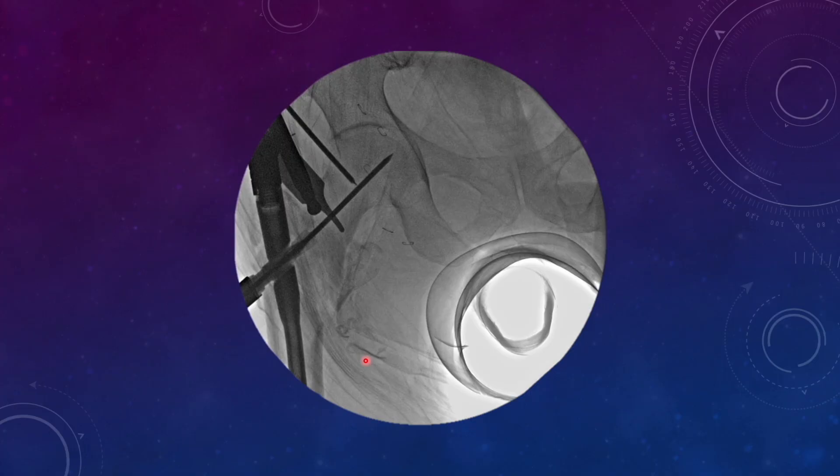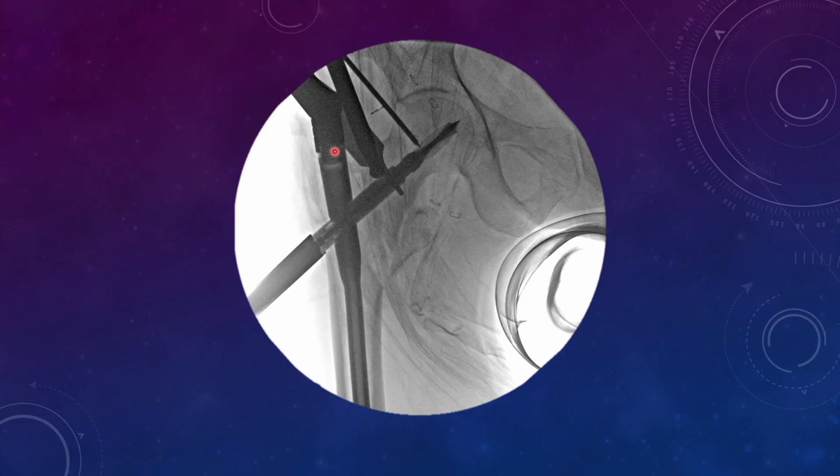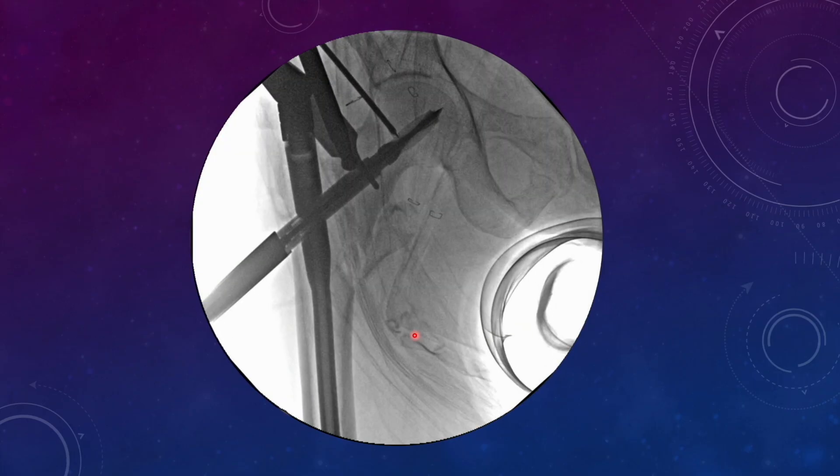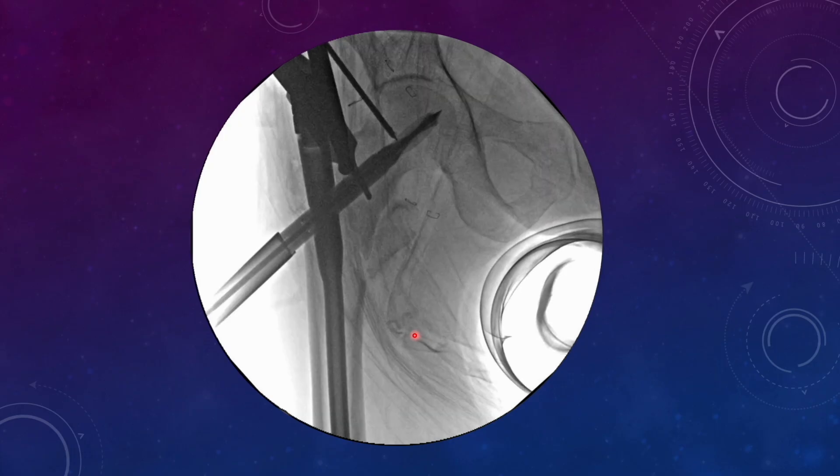He inserted the blade because the bone quality was not good, and to prevent rotation of the proximal fragment he also inserted a guide pin. He was taking care of all the forces that may occur, so the blade was inserted. Now you see there is some opening at the fracture site, so the surgeon thought of getting compression. He released the traction and tried getting compression, but while getting compression, the proximal fragment is coming downwards and this spike has now become slightly negative — the positive cortex the surgeon had achieved prior to blade placement has changed into a negative cortex.